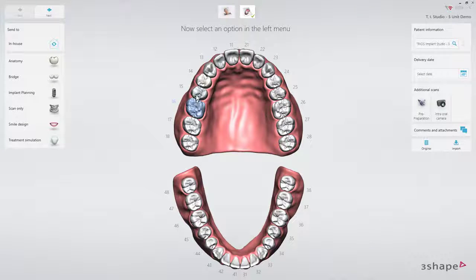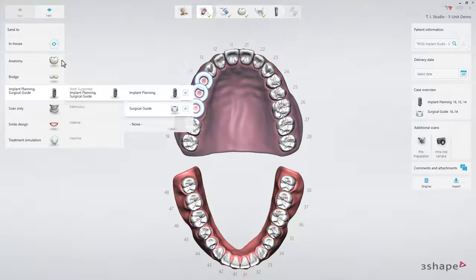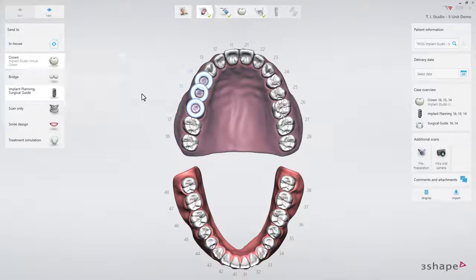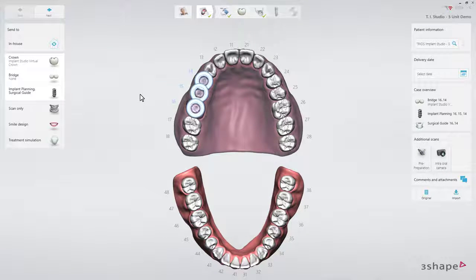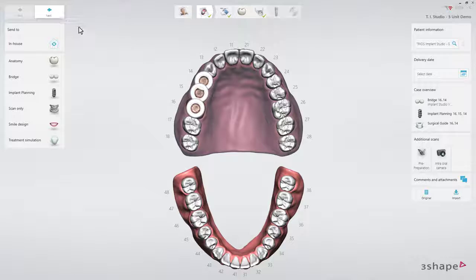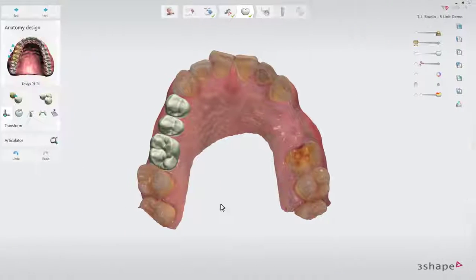First, create a case with the proposed treatment plan for three implants and crowns on top. Connect the crowns into a bridge — later this will give you the freedom of placing fewer implants if necessary, while still keeping the prosthetic design for all three teeth. Go through the next workflow steps up until the implant planning step.